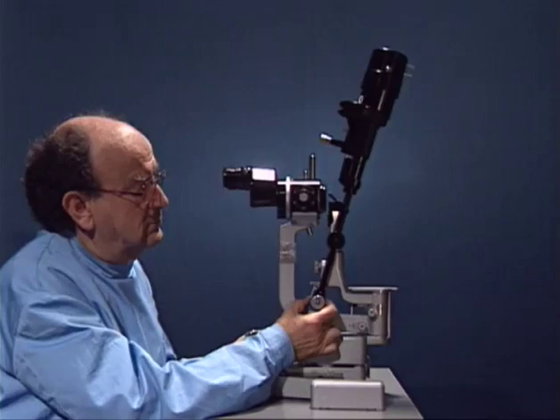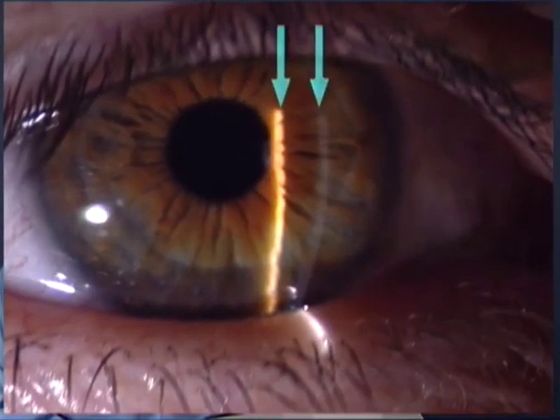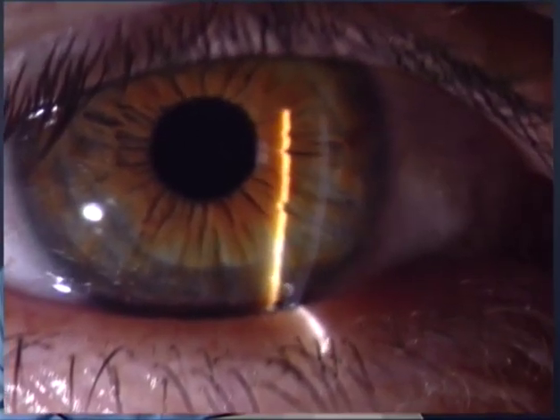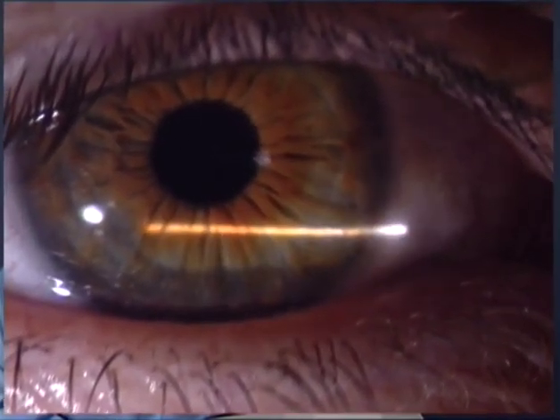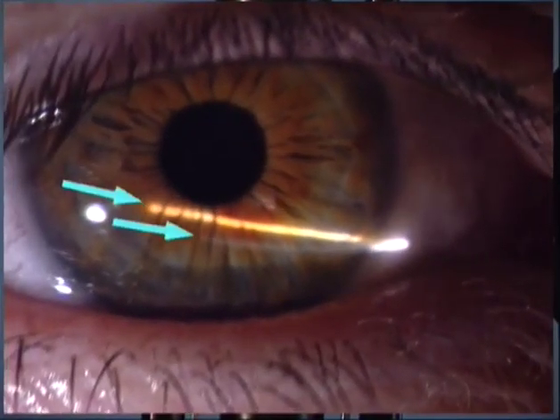When is tilting necessary? Here, light slits can be seen on both cornea and iris. On changing the orientation, only one slit is to be seen. By tilting the unit slightly, both slits appear again.